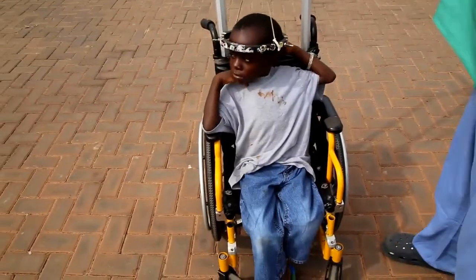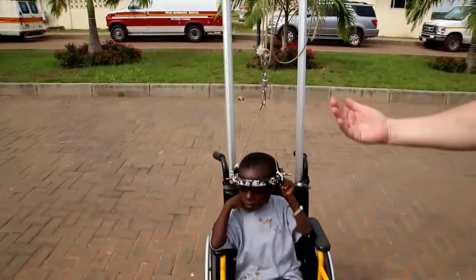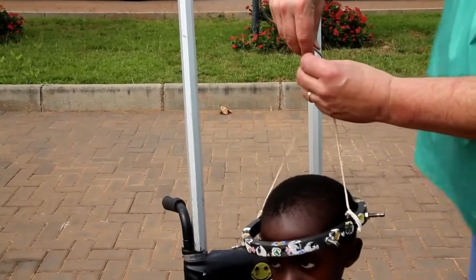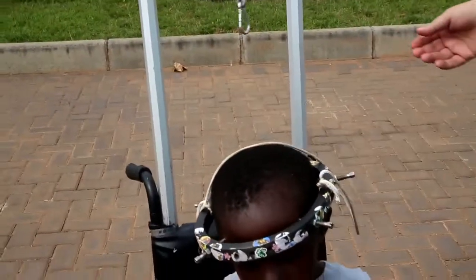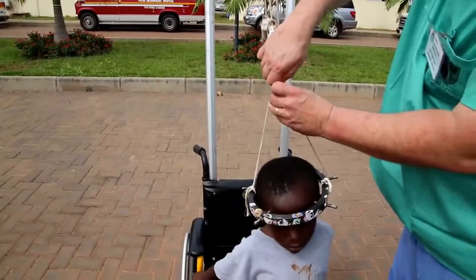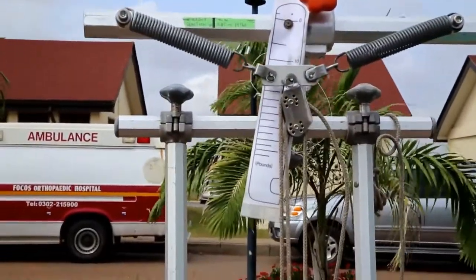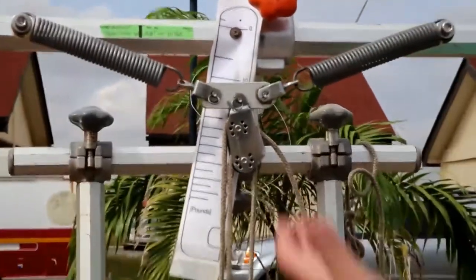Here's a neat trick the children taught us: if the patient wants to take it off once traction is set, they simply stand up, which automatically unloads the system. The patient can then reach up with their own hands and disconnect the halo. When they come back, they hook themselves back up, sit down, and they're right back at ten pounds. So once traction is set, patients will often just stand up, disconnect, go do what they need to do, then come back, hook it up, sit down, and they're right where they want to be.